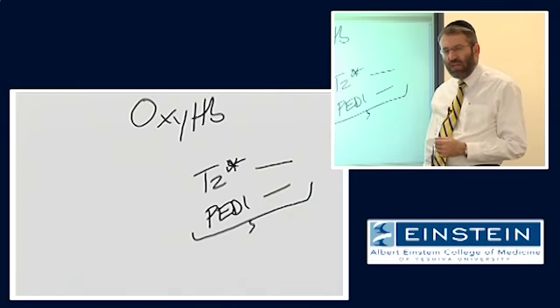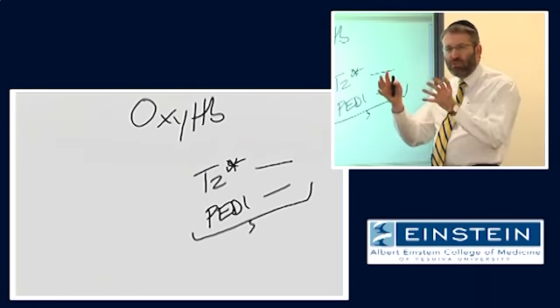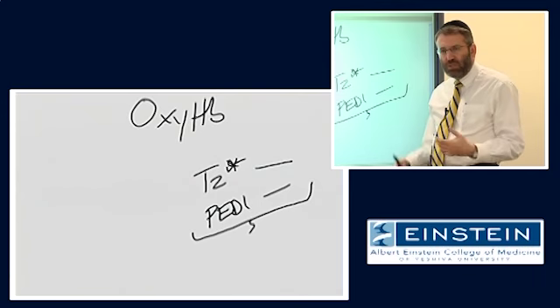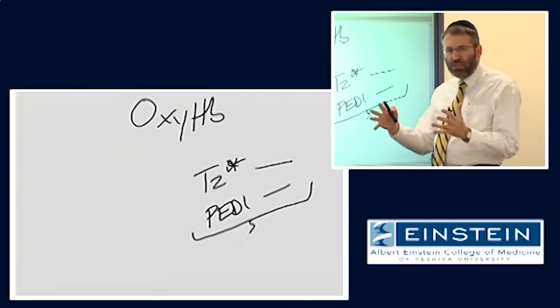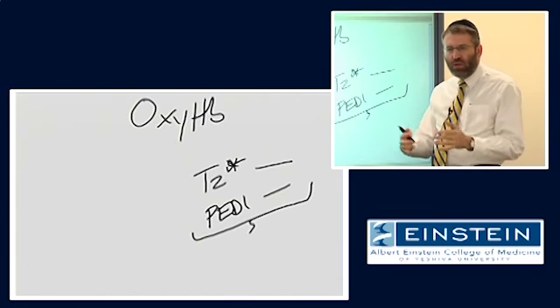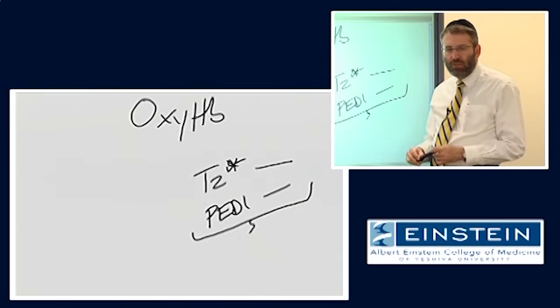And so what you're seeing, if you see slight hyperintensity on a T2 weighted image, or some rim of hyperintensity on a T1 weighted image that have been supposedly reported, that's all a function of those serum proteins and other water content of the hematoma. It has nothing to do with any of these magnetic susceptibility effects.